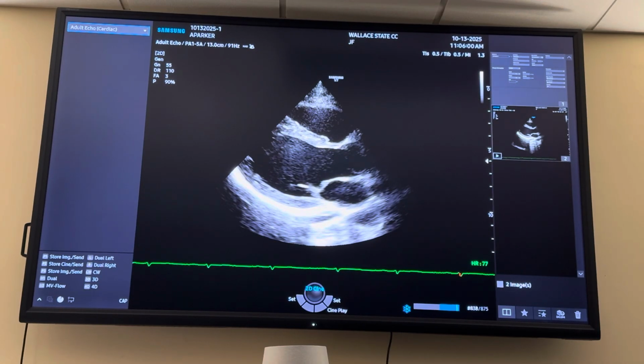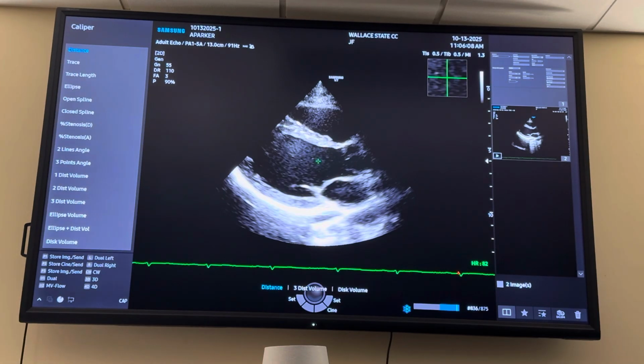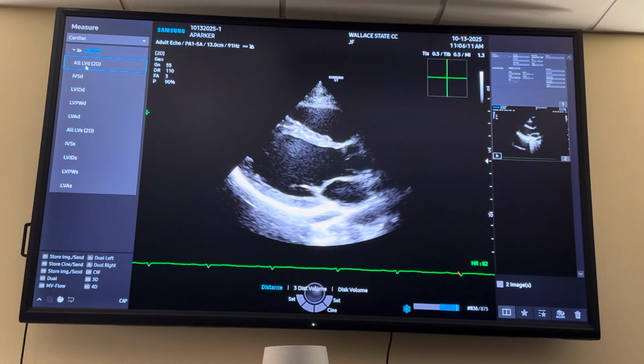The aortic valve, you can watch it here, it's trying to open. So I know I've gone too far, that starts systole, so I'm just going to come back a little bit. So this would be my end diastole measurements. You must put this in a CALCS package.